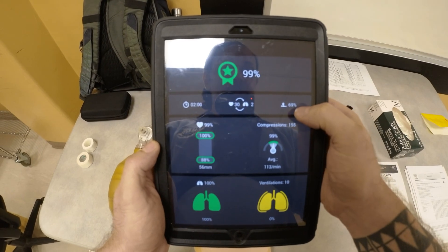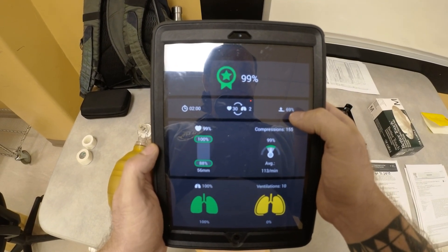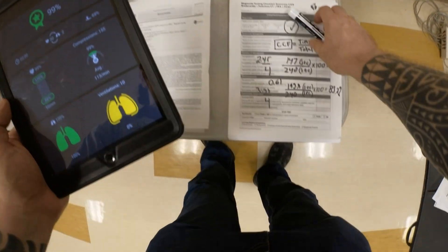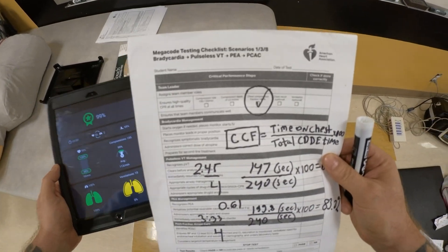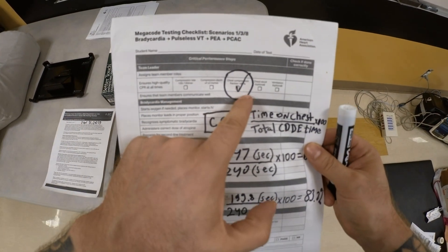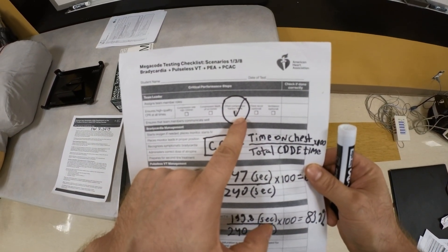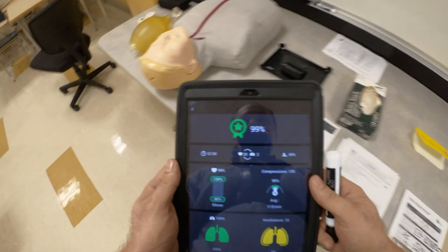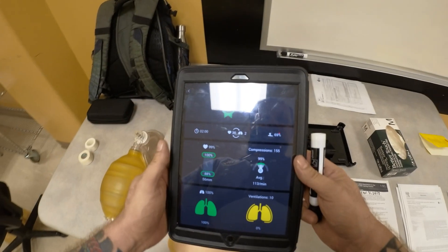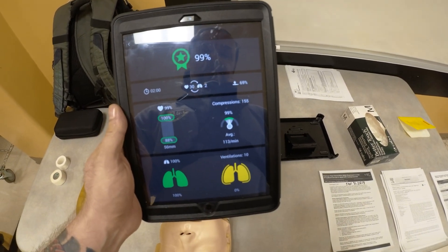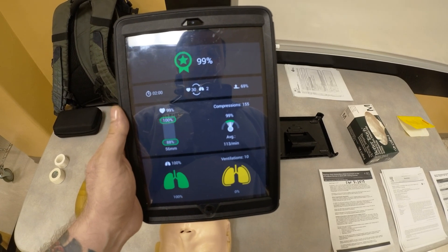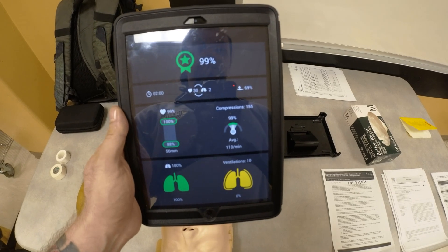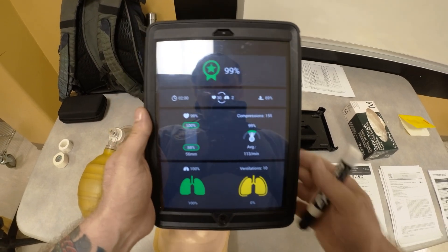We did 30 to 2, and this is our CCF. So CCF was 69%. If you look at the AHA criteria for your megacode ACLS station, we need to be above 80% for it to be a successful station. So at 69%, we are below that. The only way to get to 80% is to do compressions with ventilations asynchronously — one breath every six seconds while doing compressions uninterrupted. That's the only way you're going to get greater than 80%.